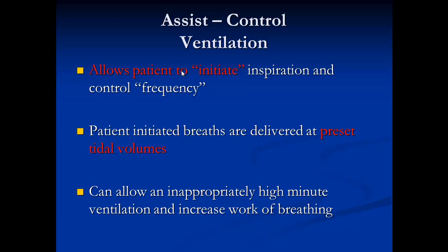Assist control, which is the most commonly used, and that's the one that I want you to put emphasis on, is also called CMV. It is typically delivered with either volume cycle or time cycle, which is pressure cycle.